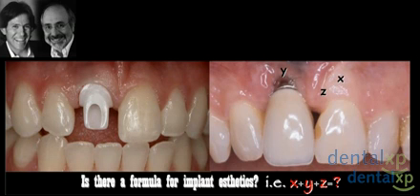So when you're talking about measuring on X, you're talking about vertically as well as the thickness of the tissue. You measure that. We measure the thickness here of the tissue, the location and presence of the labial bone either through bone sounding or through CT scan technology. And of course, the interproximal bone can be measured by CT scan or bone sounding on the adjacent teeth, which is shown very beautifully diagrammatically by Dennis and Stephen. So if we want to avoid these types of problems, we need to understand the diagnosis. We need to appreciate the surgical necessity for augmentation, either before or during the time of surgery.